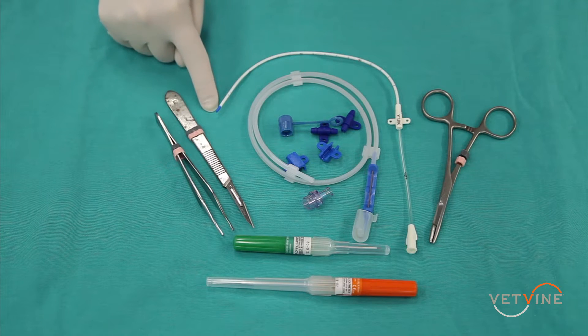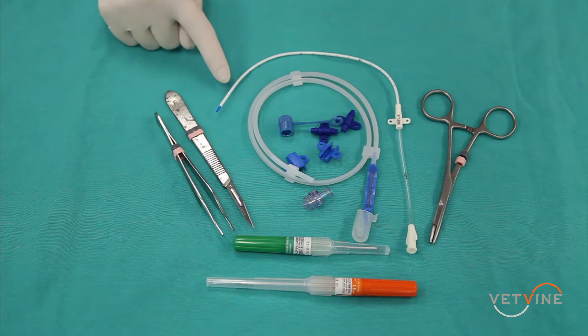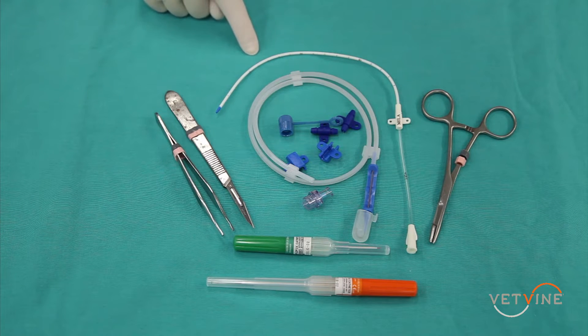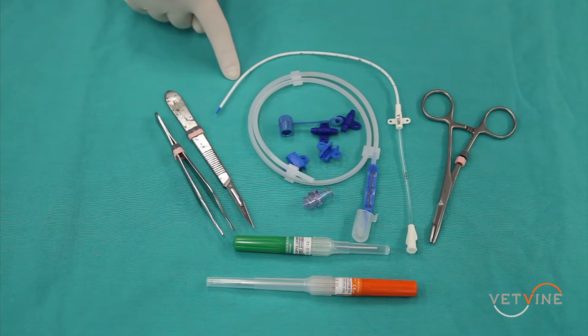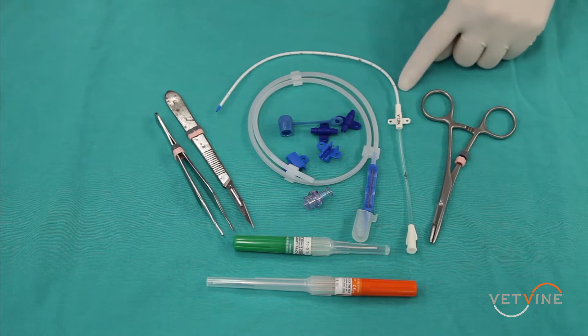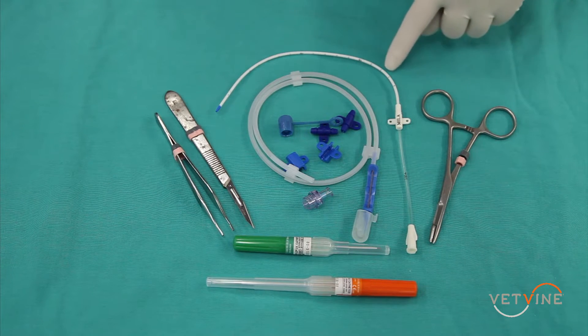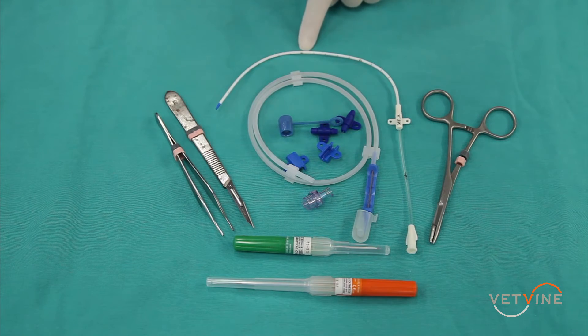In the Myla catheter, there are various lengths with fenestrations up to 4 or 8 centimeters, depending on the size of the patient. For the ones fenestrated up to 4 centimeters, use this for a kitten, whereas fenestrations up to 8 centimeters are more appropriate for a large cat or a dog. There are also radio-opaque lines that you can see to judge the length of the catheter and facilitate placement.